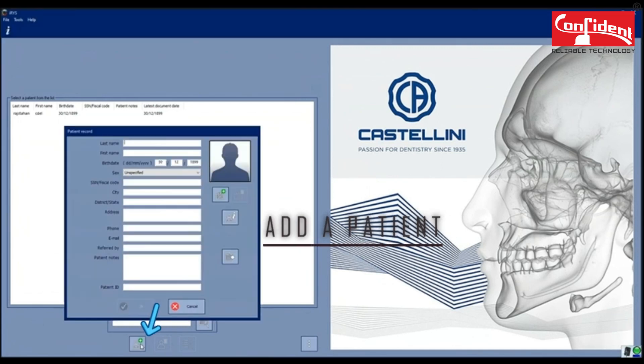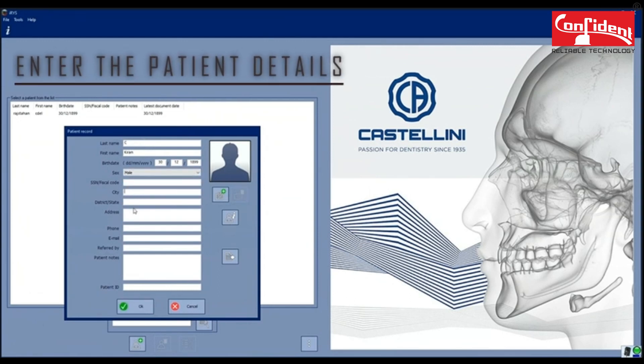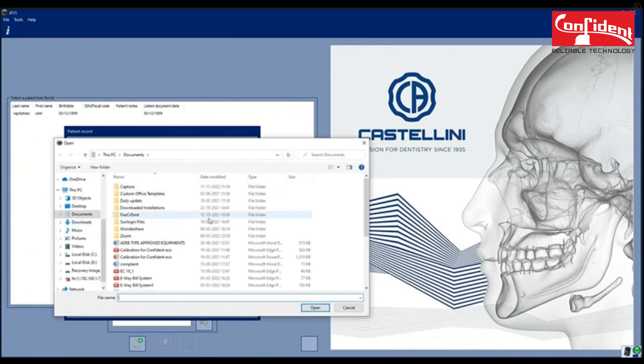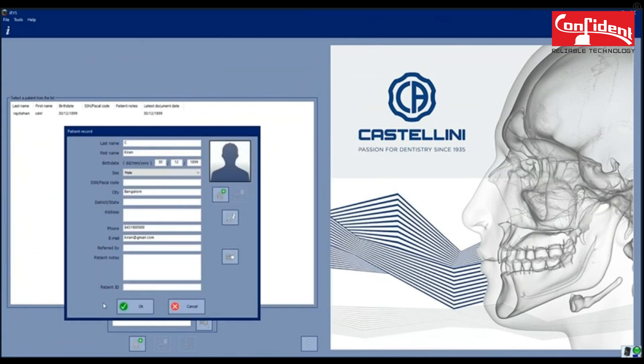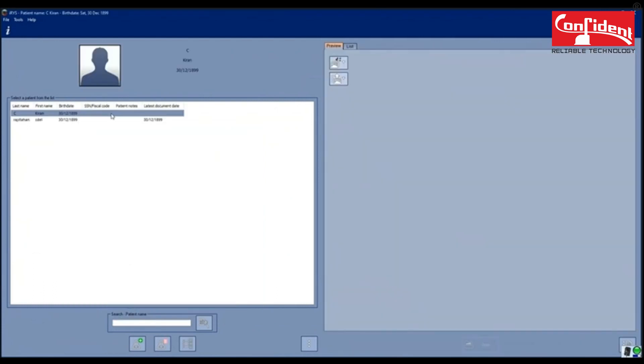Click here to add a patient. Enter all the required details in this form. You can also add an image of a patient. Click OK to add a patient.